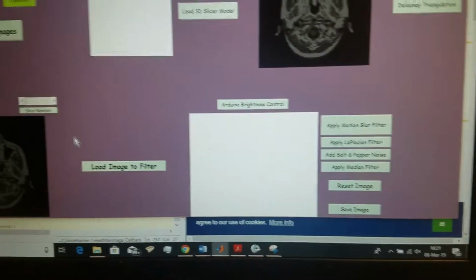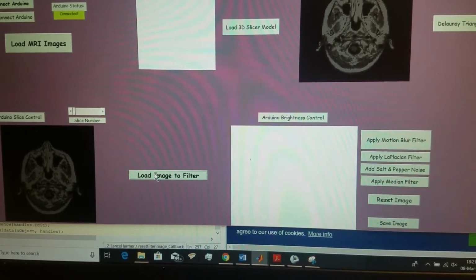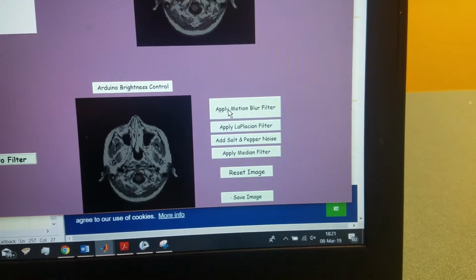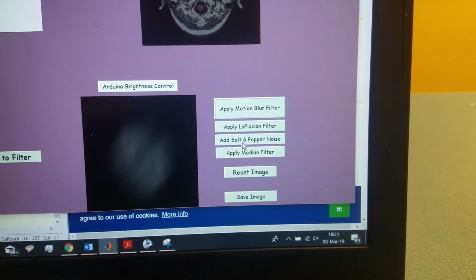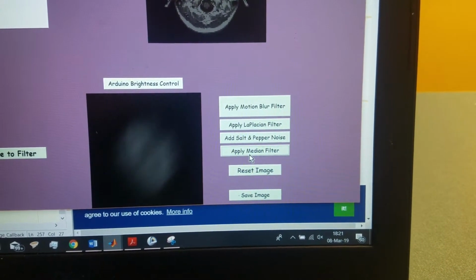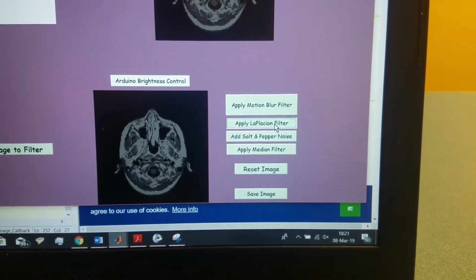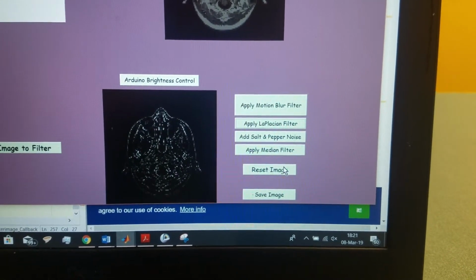Next portion shows the image filtering. So if we press load image to filter, it'll move over what we had in our slicer. You can apply things such as a motion blur filter, some salt and pepper, use a median filter to remove that. The reset button brings back Laplacian filters, sort of like an edge detection algorithm.